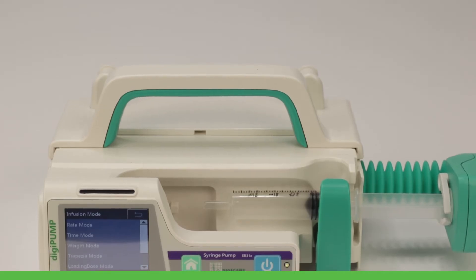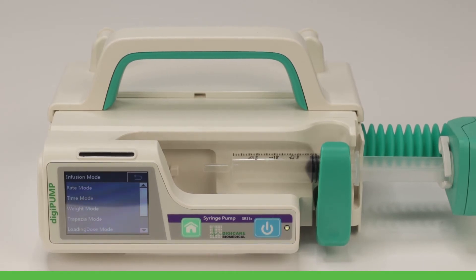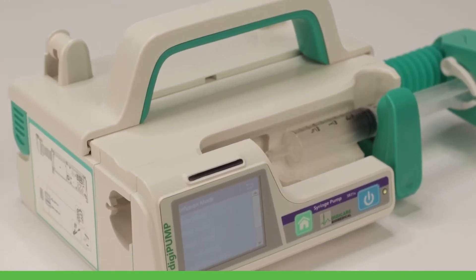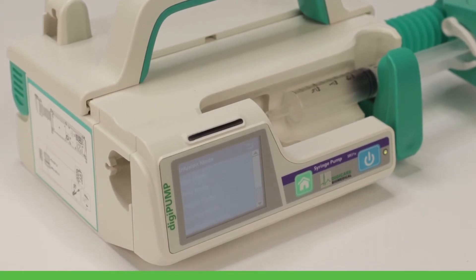The DigiPump SR31X is capable of infusing in seven different modes including rate, time, weight, trapezia, loading dose, sequence, and total intravenous anesthesia, and includes an optional relay mode when paired with the workstation for auto-continuous infusion.